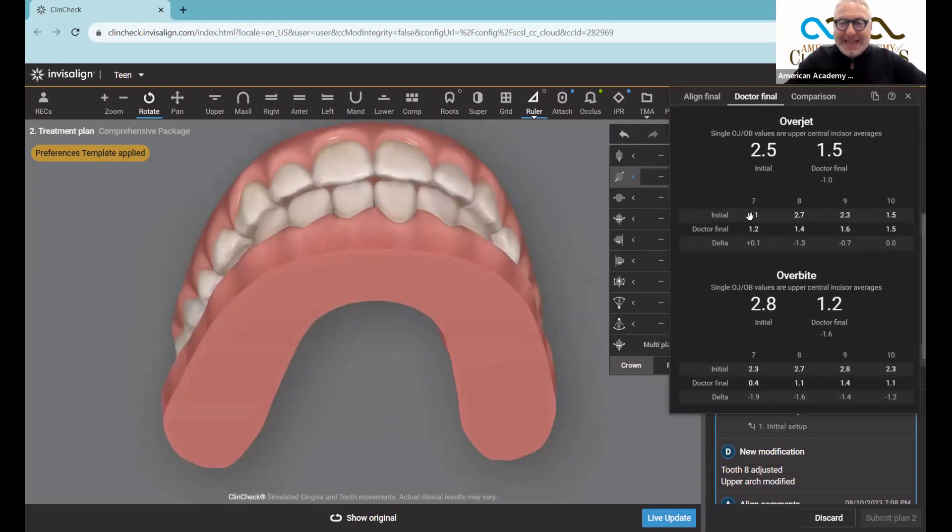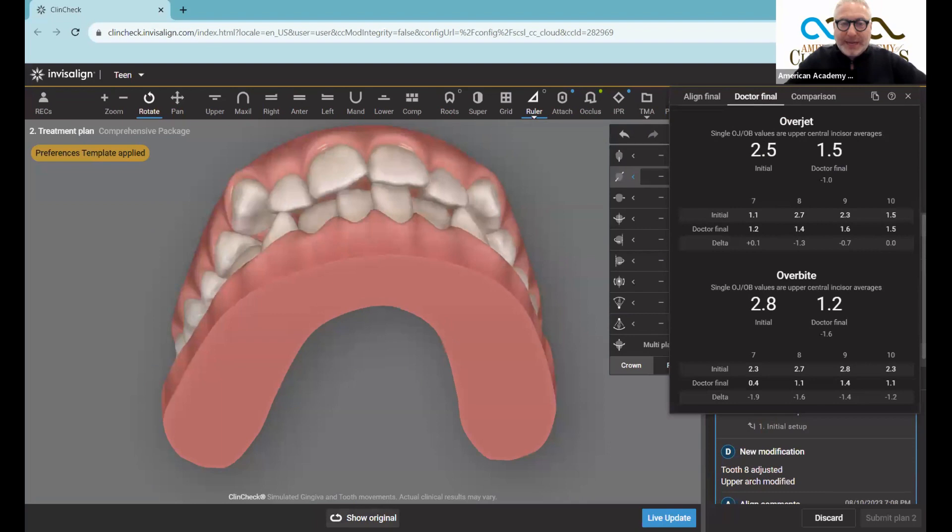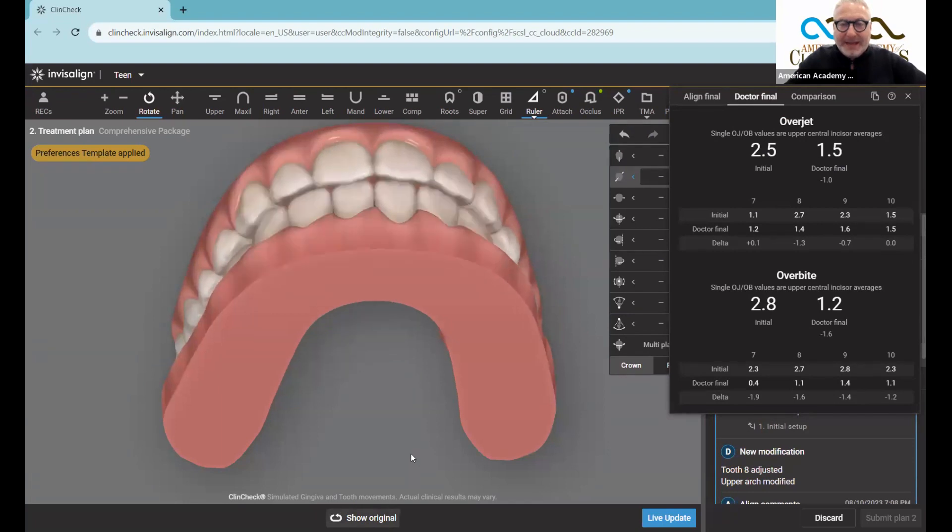What it says is that at the beginning of treatment, the initial overjet is two and a half millimeters, but then at the end of treatment, it is one and a half millimeters. So let's see what that looks like - at this point, it's two and a half, and at this point it's one and a half.